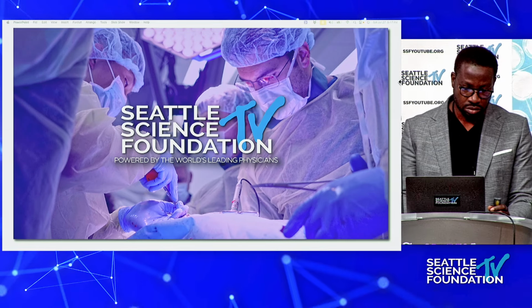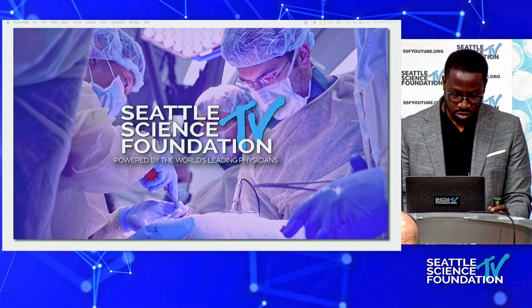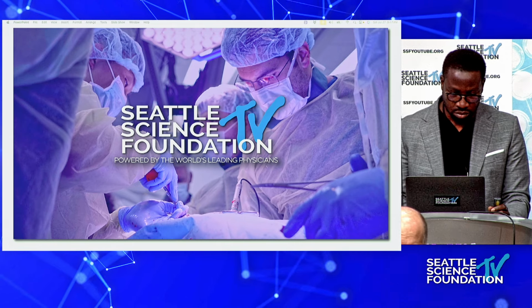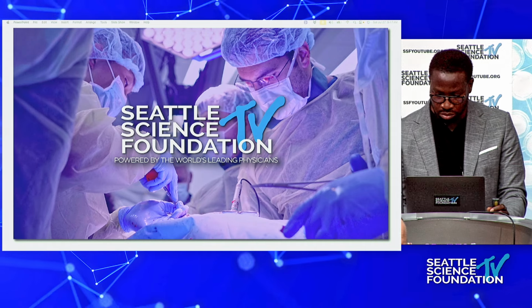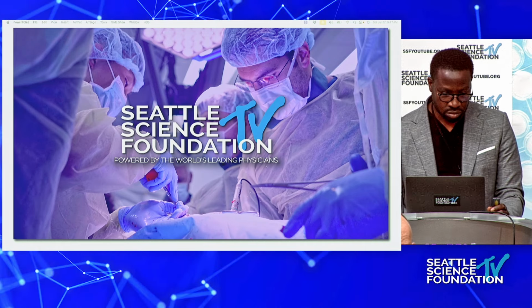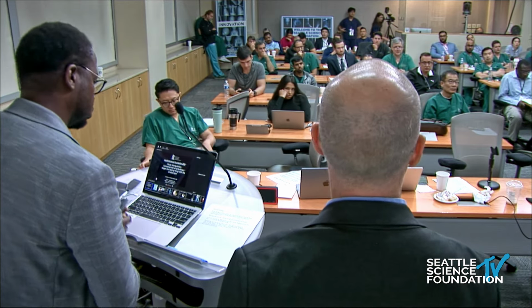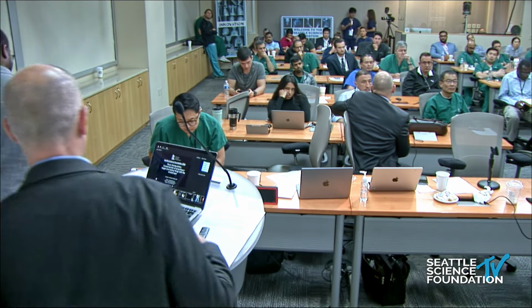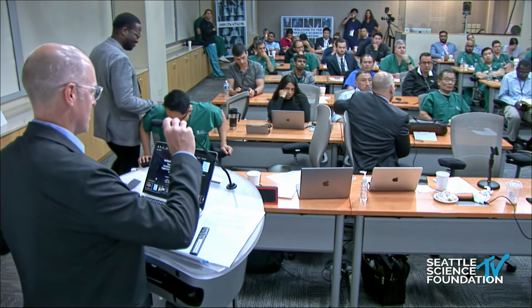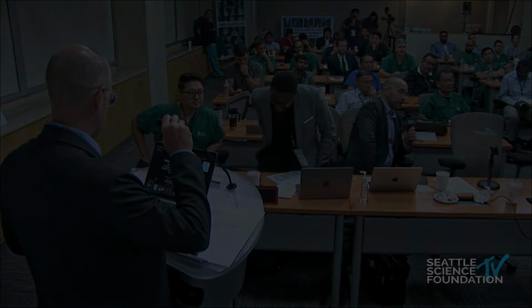We're running a little bit behind, but the targeting, as you guys have seen, is really one of the trickiest points, because when that doesn't work out, you really get lost, right? Soft tissue handling is another big piece of the learning curve, because you have to make an artificial space. It's not like a joint or a pulmonary cavity or anything else where you have a space that is available. You have to create this, and it doesn't come natural, and it takes skills. So the next step.